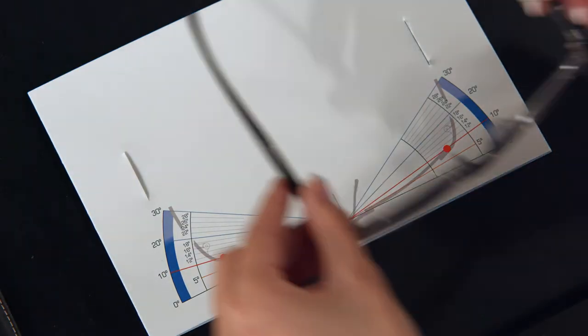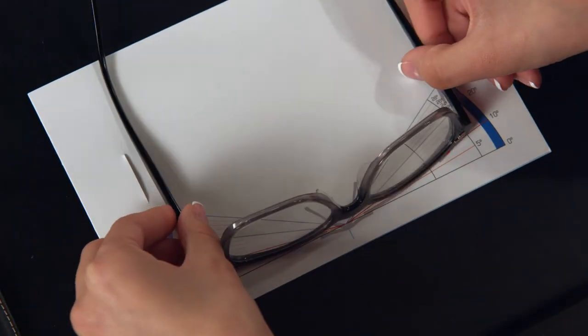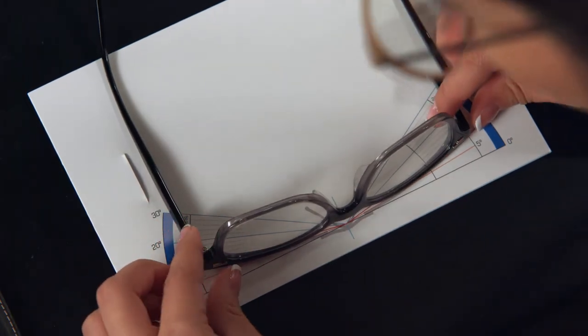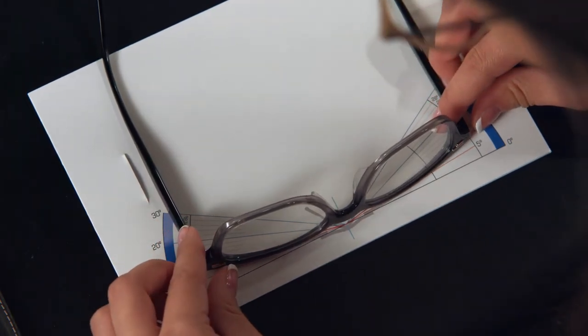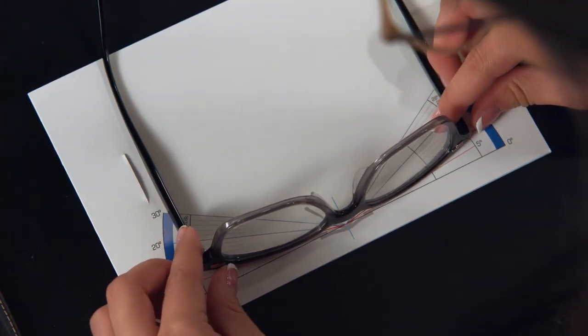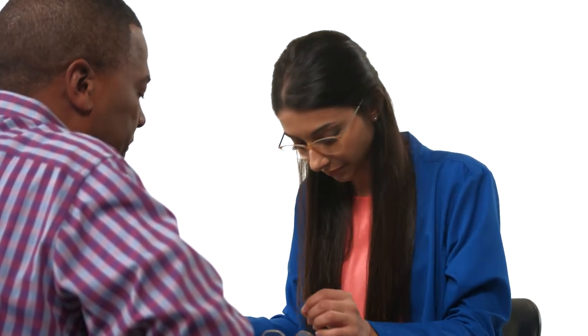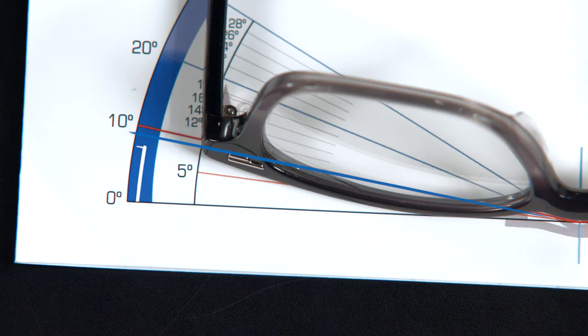To measure the wrap angle, place the frames on the chart so the bridge is aligned with the zero-degree line. The wrap angle is measured where the lens ends near the frame hinge. In this case, the wrap angle is nine degrees.